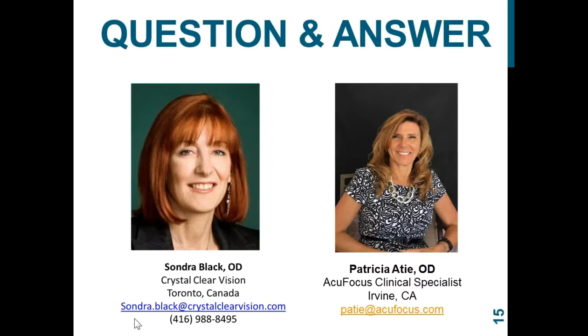If they're in just distance glasses, I will go ahead and have them keep their distance glasses on, show them what LASIK will be, how it'll be, for their distance, and then I go ahead and have them read. And then you may say, well, no, I usually take my glasses off to read. Well, exactly. Once you have the LASIK done, it'll be like keeping your glasses on, so you see that it's going to be difficult for you to read. And then, again, that wonderful pinhole. I show them the pinhole, see how well it'll be. If you have this done, you'll be able to read.